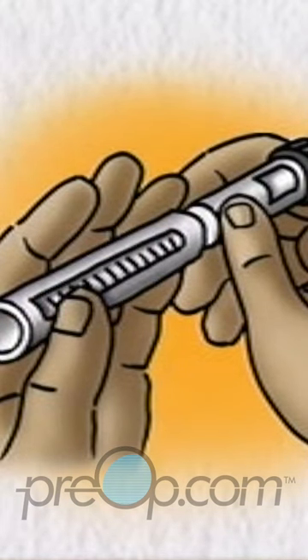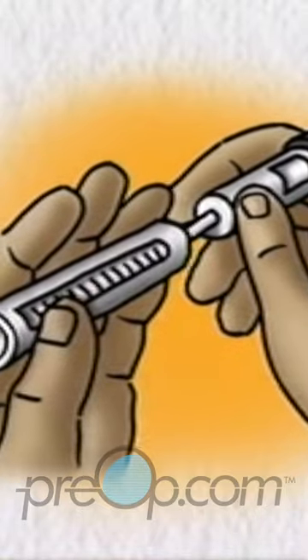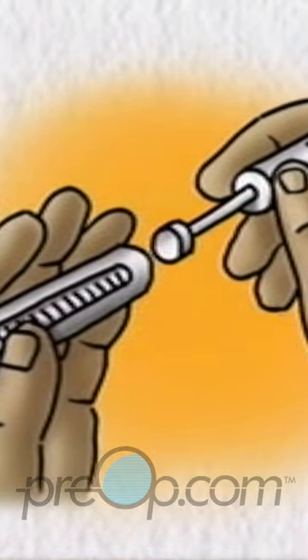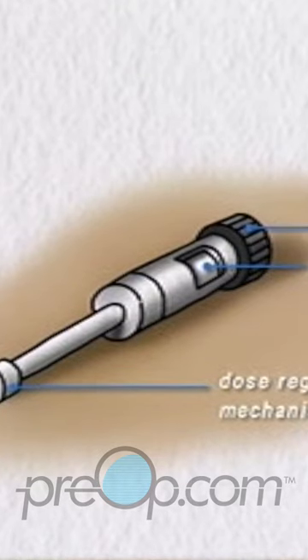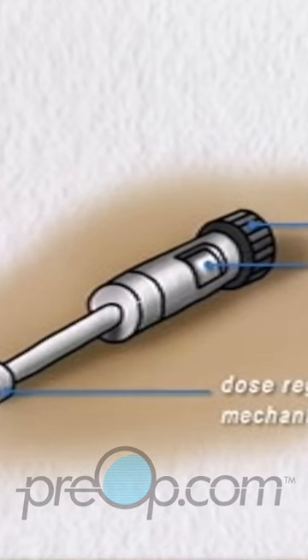Follow the manufacturer's instructions to remove the cap. Separate the base from the cartridge holder by unscrewing it. Rewind the base dose regulating mechanism back to zero and put down the base.